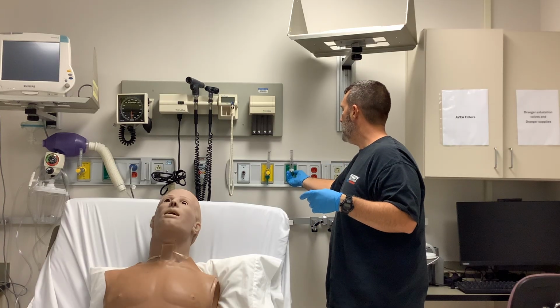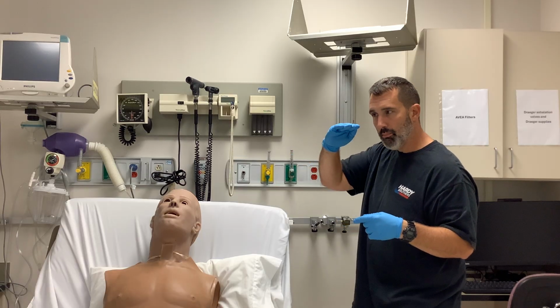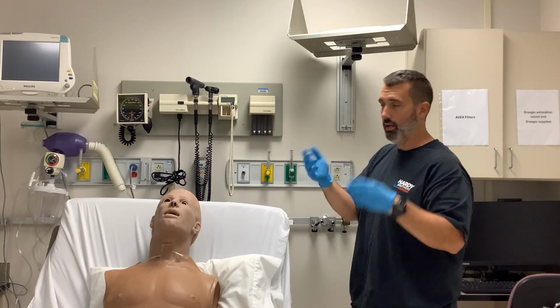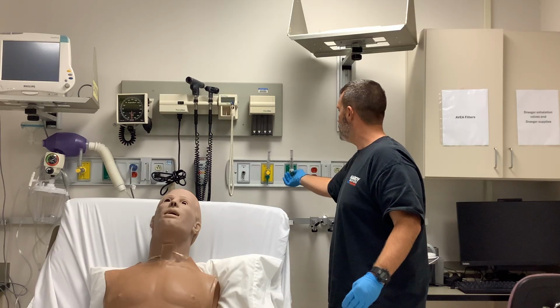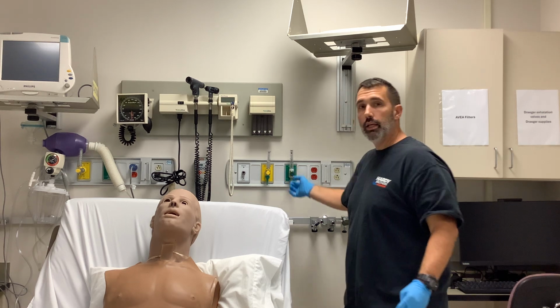So that's 2 liters, and when you're setting your flow, make sure you're reading it at eye level and that ball is bisected by the number or the line going through the number. Don't look at it from an angle because you may set the wrong liter flow. So I'm going to go ahead and turn this up to 15. That's 15 liters per minute of flow.